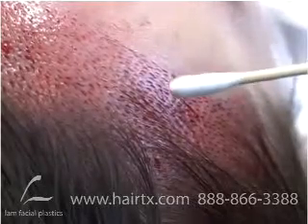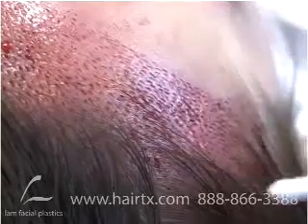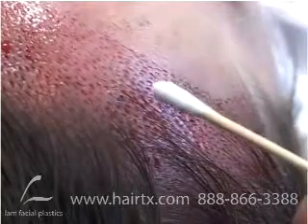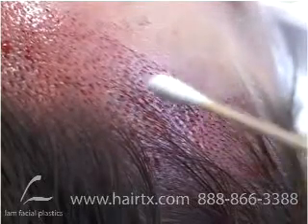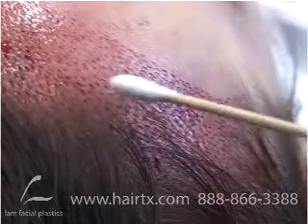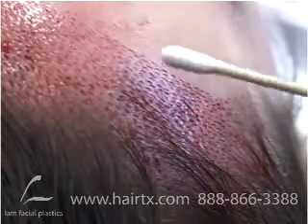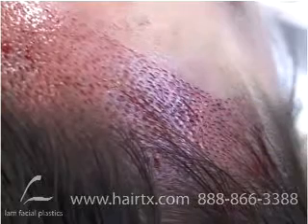About 95% of male hairlines move anteriorly. These all go posteriorly. The sides are actually angled this way. It's hard to see because they just look like little tiny holes, but they're going back this direction. So they're sweeping back and then sweeping down anteriorly. And this is going to be different from the left side. Let's go take a look at the other side.